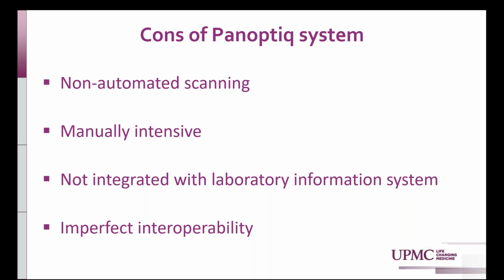Like most other whole slide imaging systems, this system exists as a standalone system and does not have direct interfacing with a laboratory information system. This is not necessarily a problem with Panoptiq, but also on the LIS vendor side, a need for better integration of these upcoming digital pathology systems with laboratory information systems.